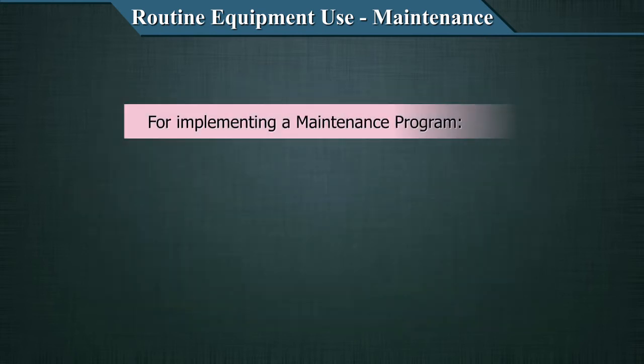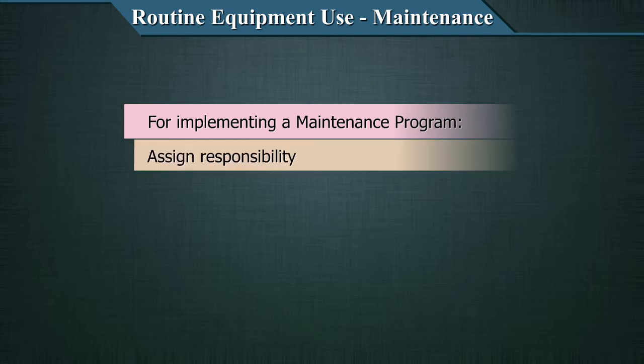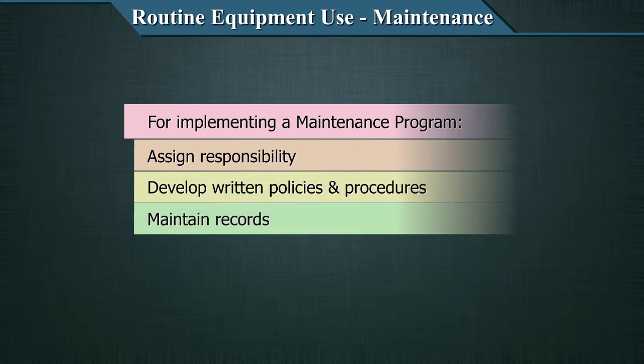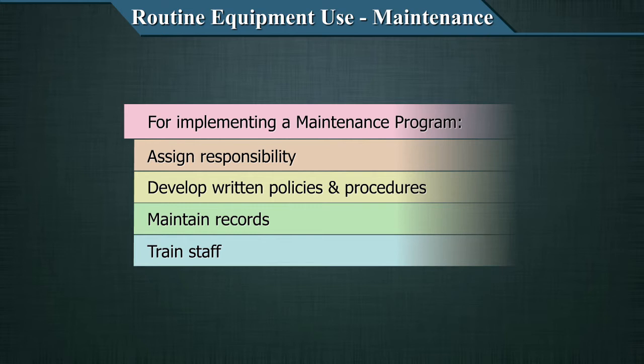Now that you have a plan for maintenance, you have to implement it. Not making the plan alone is not enough — the implementation should be done. Establishing a plan is the first part, and implementing it is the next key step for maintenance qualification. For implementation, you have to assign responsibilities, develop written policies and procedures, maintain records, and train staff. All of these are very key aspects of implementing your maintenance plan.